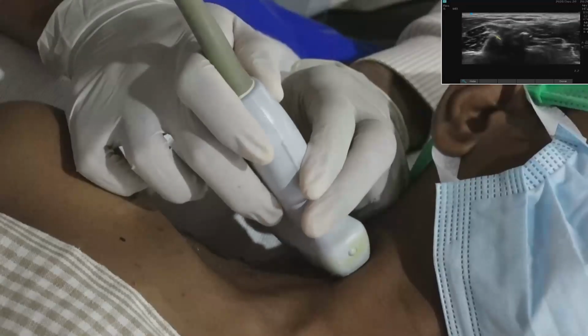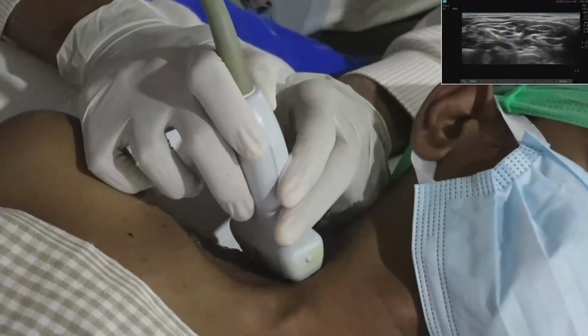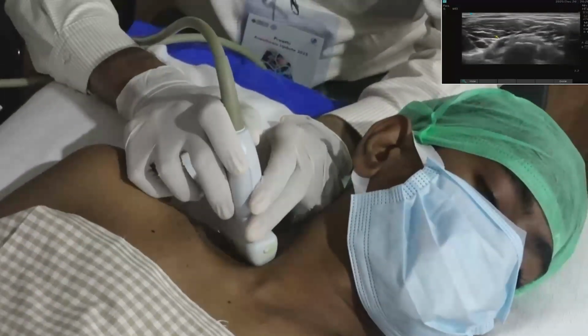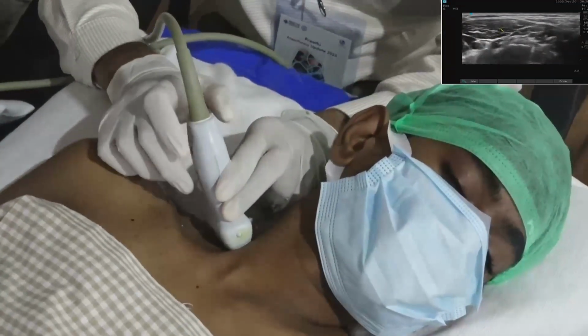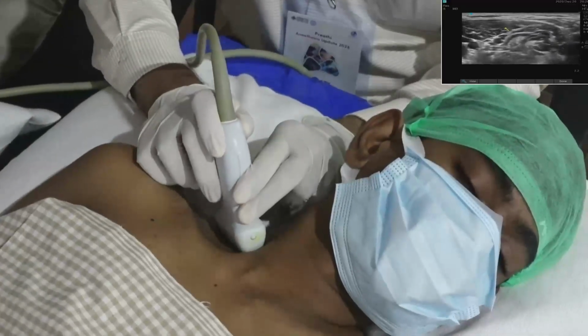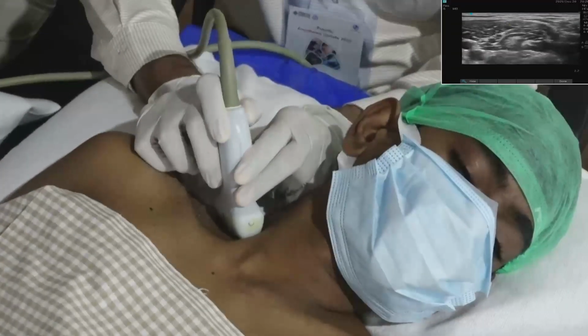Further cranially, it is better to trace the C5 because the C5 component is moving and going further away. So one of the important advantages of the upper trunk is we will not usually miss the C5 if you trace properly.